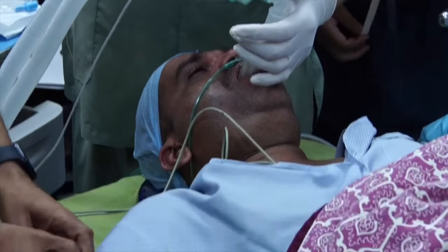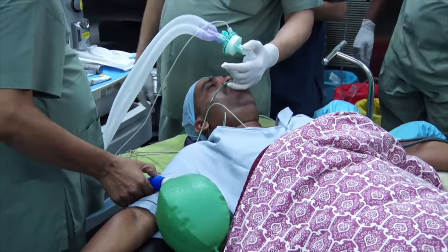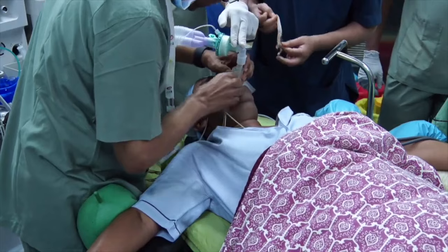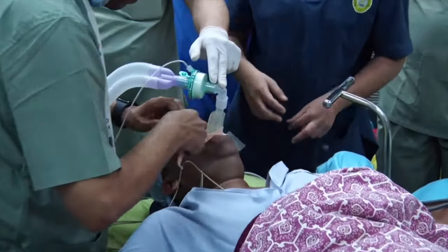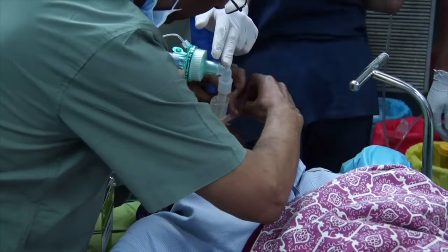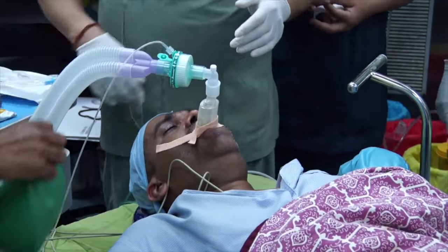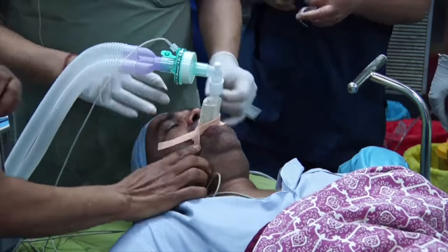Build up your concentration, leave it on the higher side. One thing you have to remember with Propofol: you will get some involuntary movement. That does not mean the patient is not asleep — it's a known fact. People will panic and think about paralysis, but just let the concentration of the volatile agent build up and it's done.